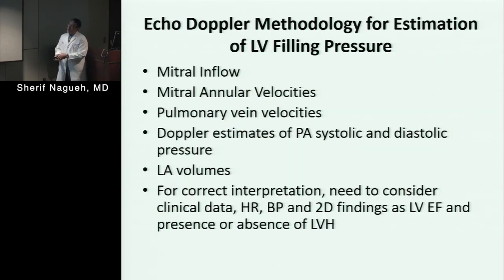So what is the available echo Doppler methodology for estimation of LV filling pressures? For talking about echo Doppler, there are other imaging modalities. They do not come close to echocardiography for that objective.